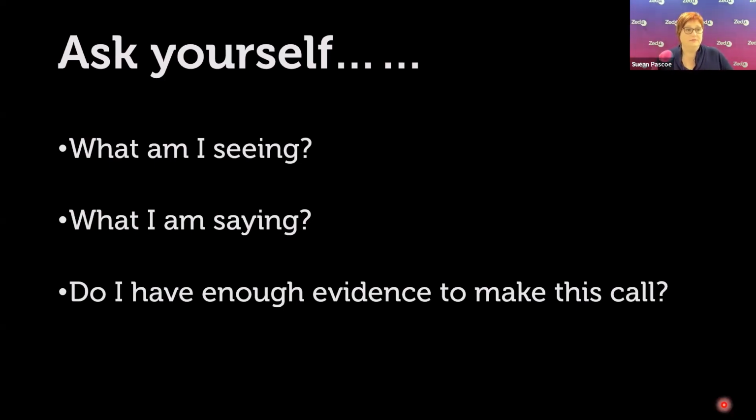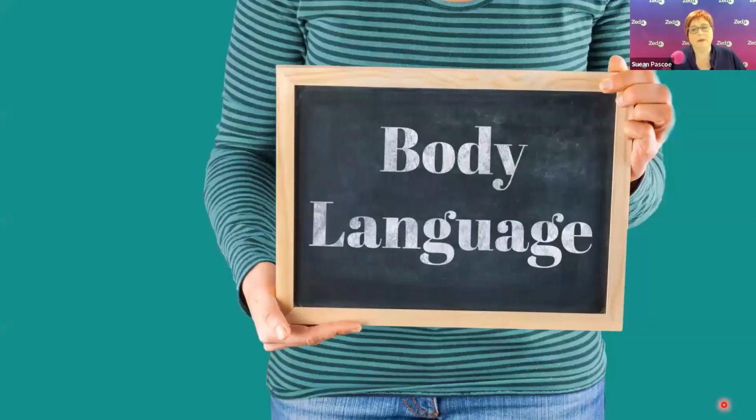Then ask yourself, what am I seeing? What am I going to say? And do I have enough evidence to make this call? And if you don't know, then it's a rescan. So what are you seeing? What are you going to say? Do you have enough evidence to make the call? And then you're going to take a big breath.